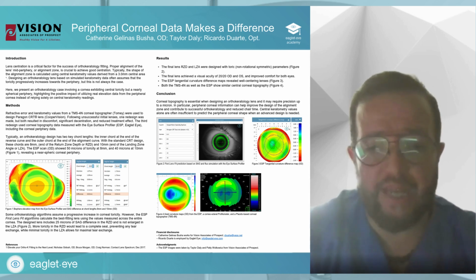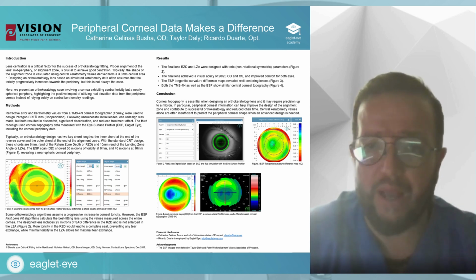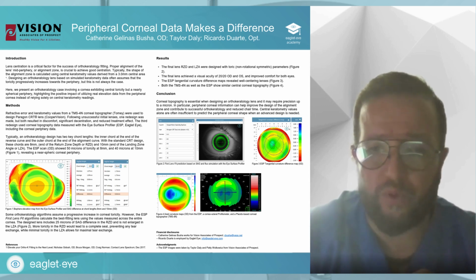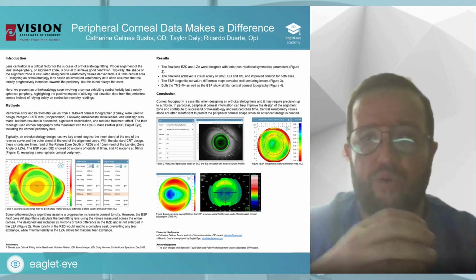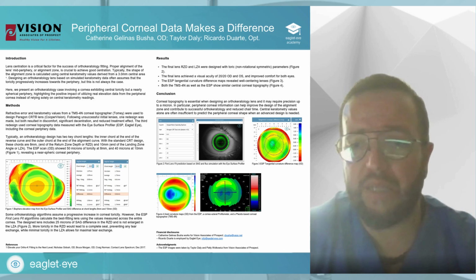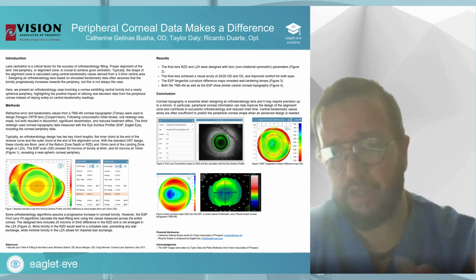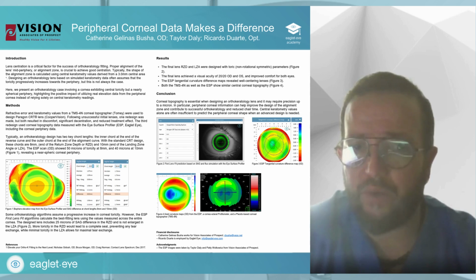And this is the case for a patient of Dr. Katerina and Dr. Taylor Daly, which they actually had this patient where they were fitting with a corneal topographer, which, as you know, it can give you a measure of 8 to 9 millimeters. So they went and they actually did the first lens fit with the topographer, and they got not that great result.